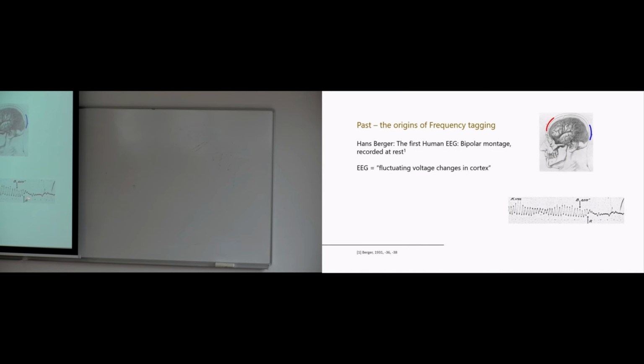In his case, this is the very typical case where on this paper strip that the pencil was scribing on, he instructed the participant to close their eyes, and then you can see what we now know as the alpha rhythm appear. So the first thing that you actually saw in the EEG, on top of the motion artifacts of the participants, probably was something rhythmic, right?